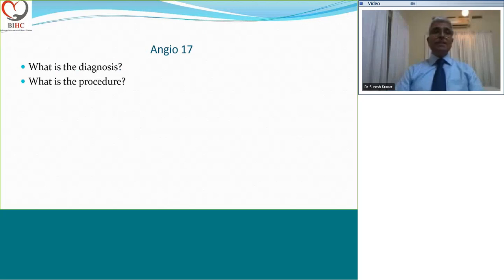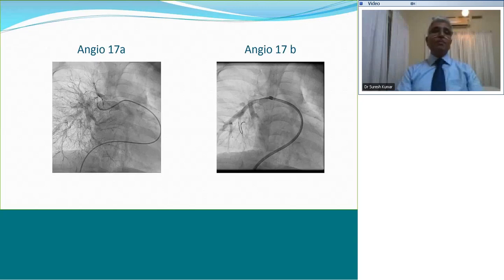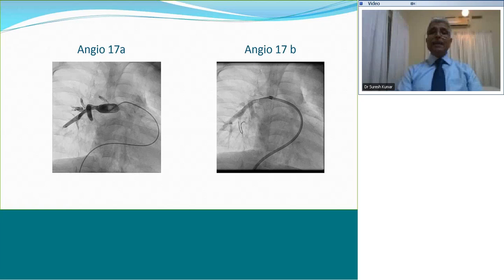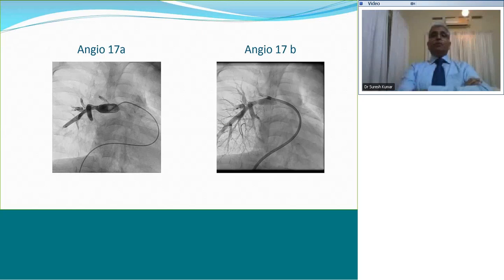Now, angio 17, again tell me what's the diagnosis and what's the procedure. Maybe that frozen 17A should help you appreciate what is being done in 17B. Okay? Tell me what it is?